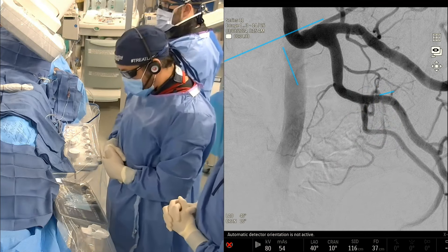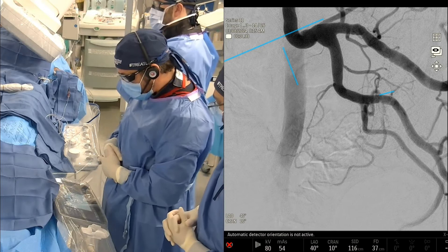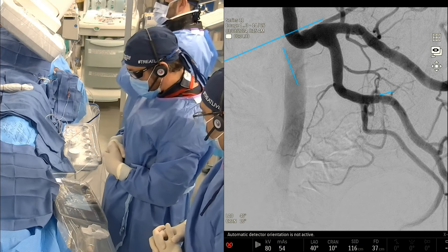Do we all agree? This is a classic type 4 origin, although it's a little angulated. Before we cannulate these, what I like to think about is which microcatheter would give us the best chance of cannulating this, and which wire.